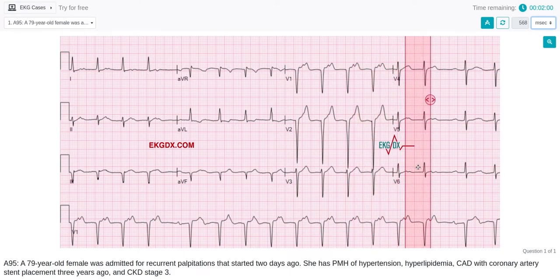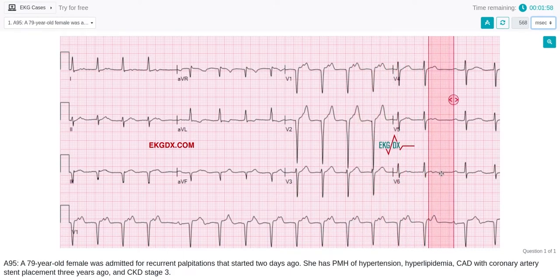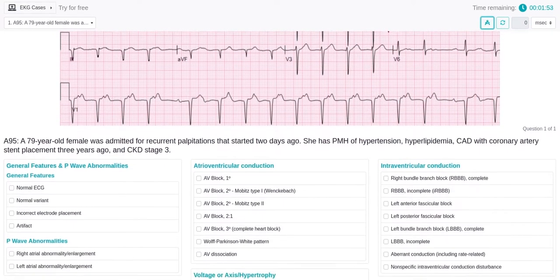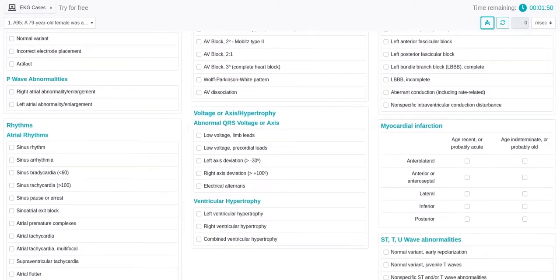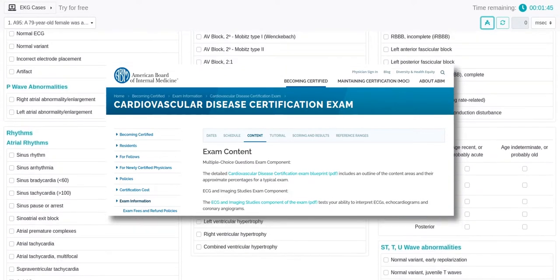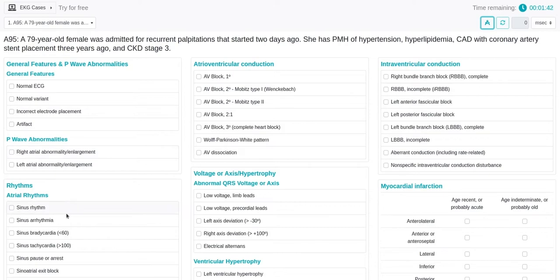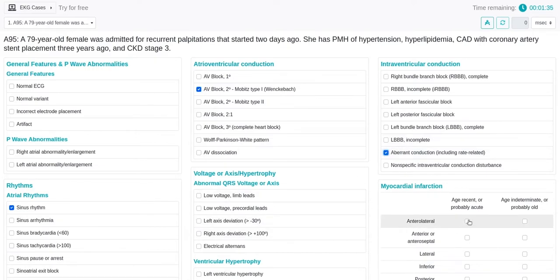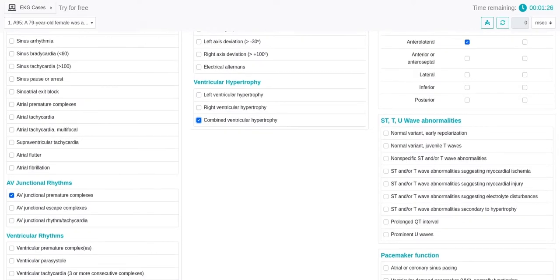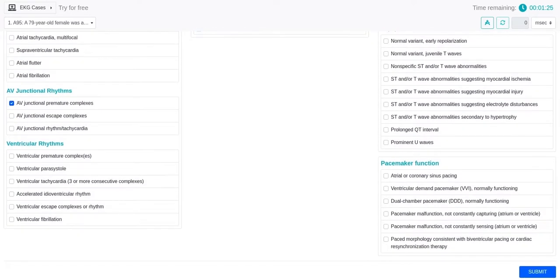Now I'm going to measure the PP intervals to see if they are regular. As you can see, they are regular. Below the EKG, you can find a brief history of the case. The EKG answer sheet is similar to the American Board of Internal Medicine Cardiovascular Disease Certification Exam. I'm going to select several random answers so you can see how the system evaluates them. After you finish with the selection, click on the Submit button.